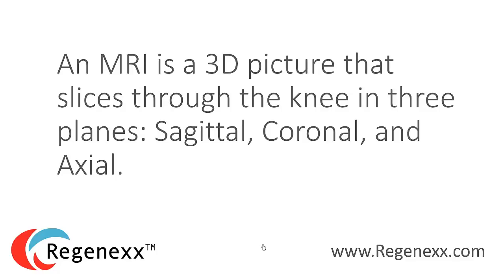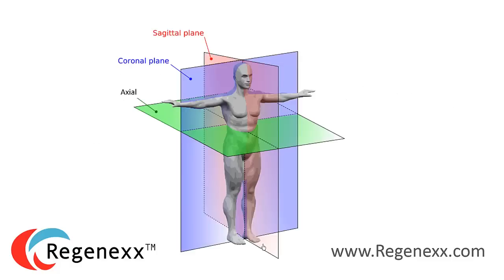An MRI is a 3D picture that slices through the knee in three planes: sagittal, coronal, and axial. The sagittal plane is a side view — essentially a saw-you-in-half view from the side. The axial plane is a traditional top-down saw-you-in-half view, and the coronal plane is from the front.